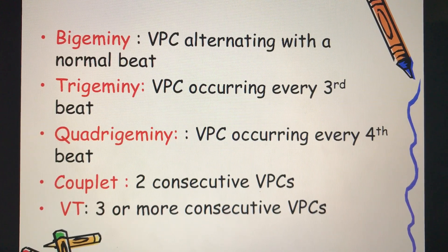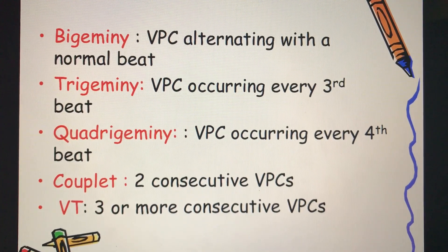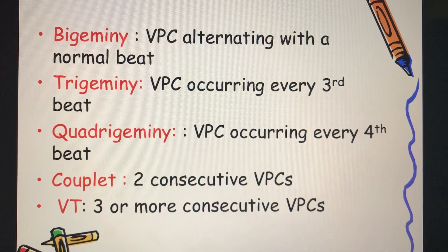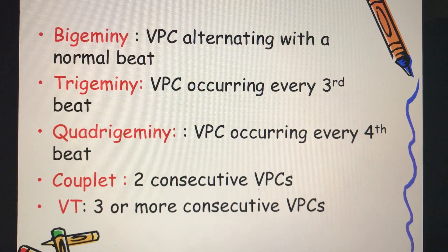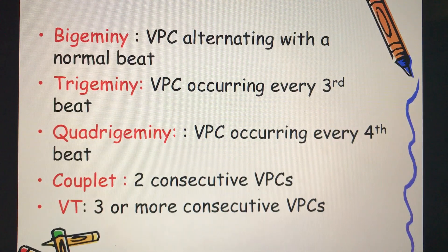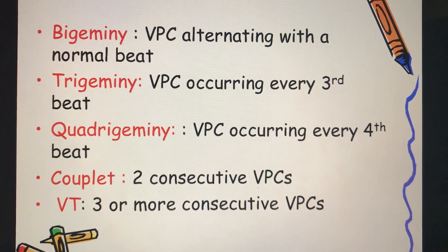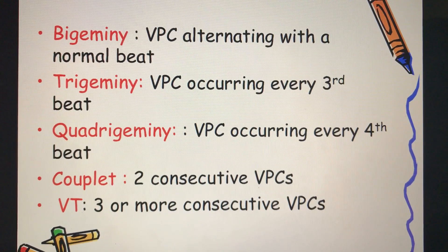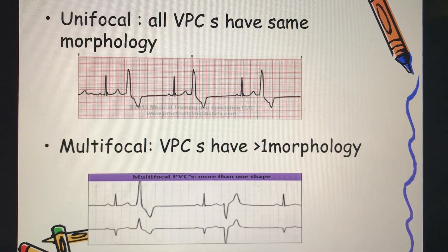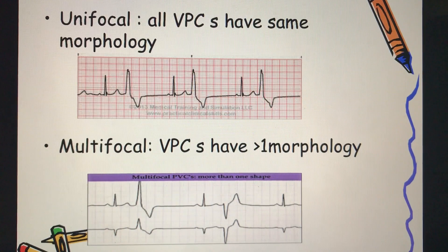There are multiple ways to describe a VPC. We call it bigeminy when the VPC alternates with a normal beat; trigeminy when the VPC occurs at every third beat; and quadrigeminy when the VPC occurs at every fourth beat. If there are two consecutive VPCs, we call it a couplet; if there are three or more consecutive VPCs, we call it ventricular tachycardia.